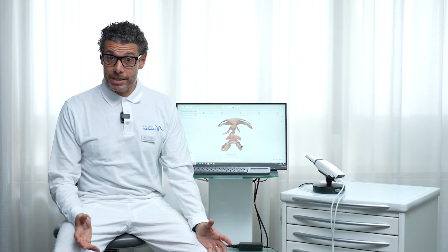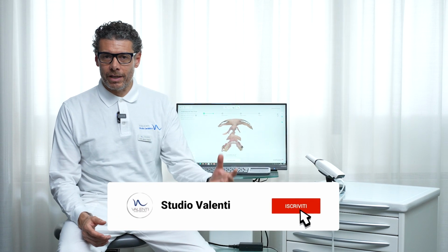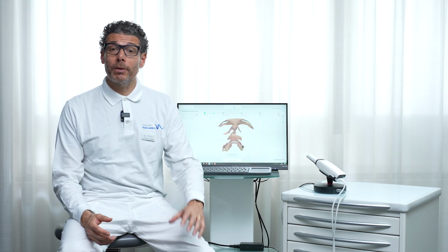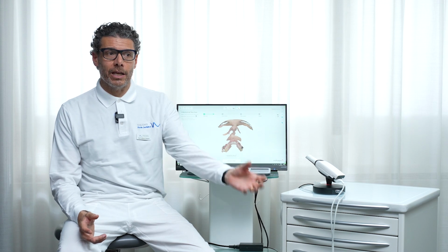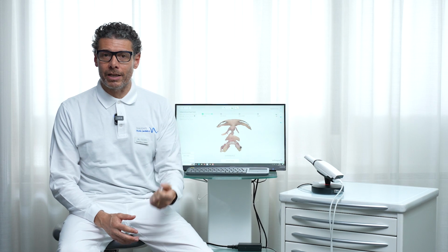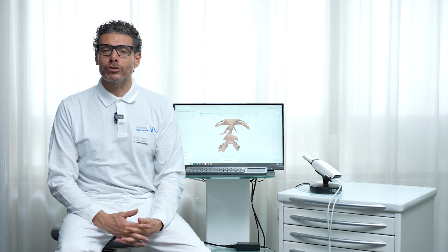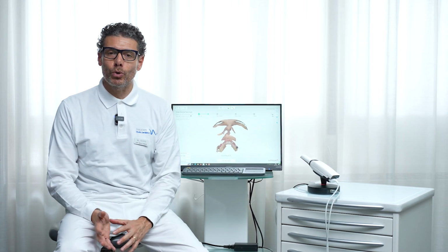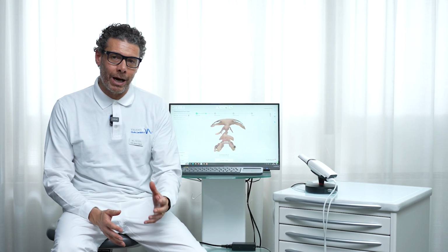The clinical part has concluded, so I showed you how to take facial scans with the RayFace scanner, how to superimpose facial scans and intraoral scans automatically with the RayFace software, thanks to the communication between RayFace and 3Shape Communicate software. In the second part, I showed you how to detect the perioral scan that will be needed in case we cannot do the automatic superimposing within the RayFace software.